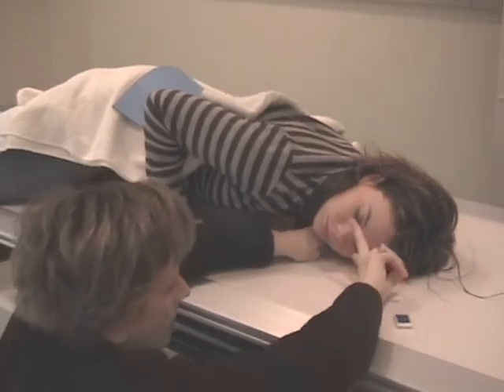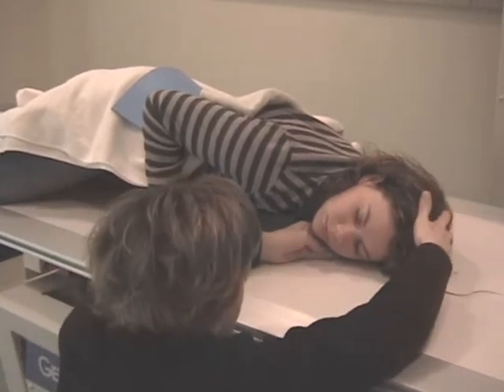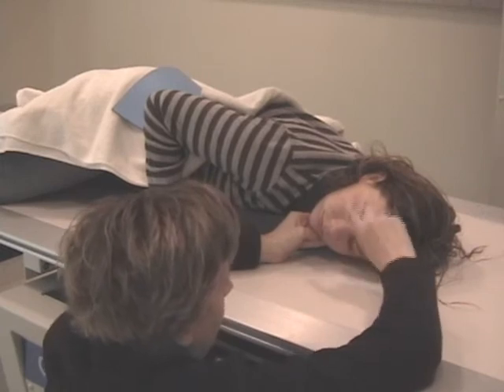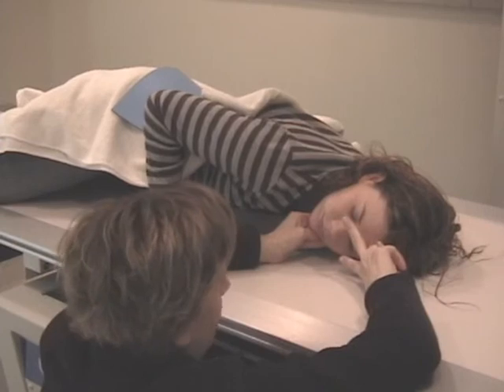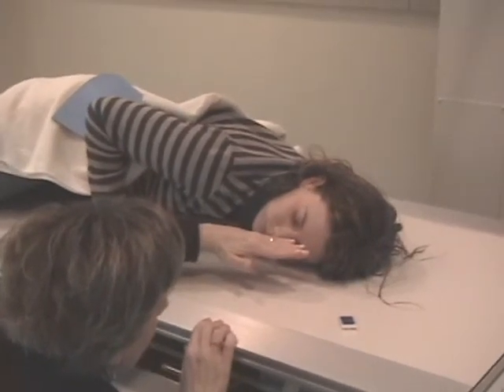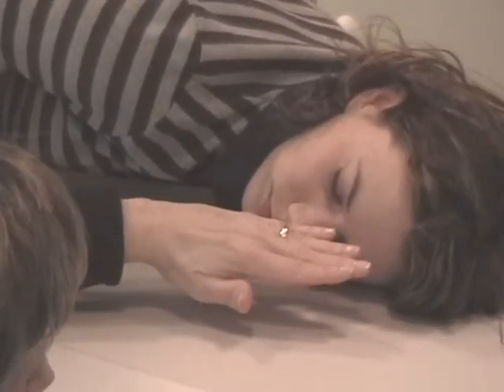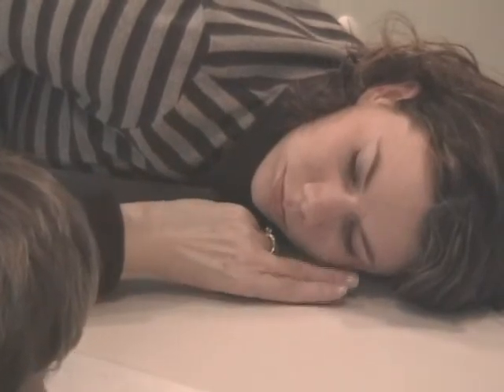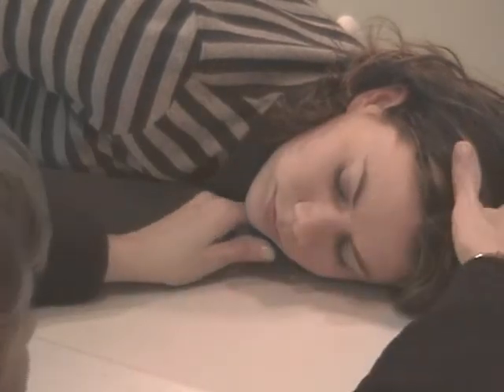Okay, I'm going to focus on the interpupillary line first. Tuck her chin. And I'm getting the interpupillary line perpendicular. Again, you can use a pen or some kind of straight edge to make sure you get that relationship. And then the MSP is right here. If she's looking down, you don't want that, and you don't want her looking up. So I'm going to look at the canthus of the eye to the lateral aspect of the zygoma and make that equal on the two sides.